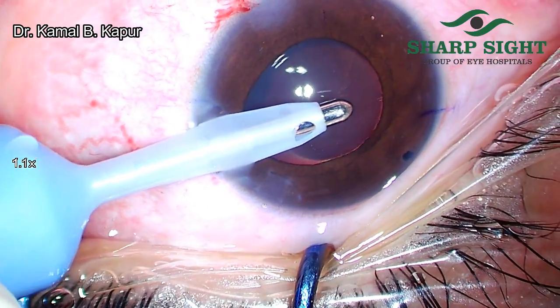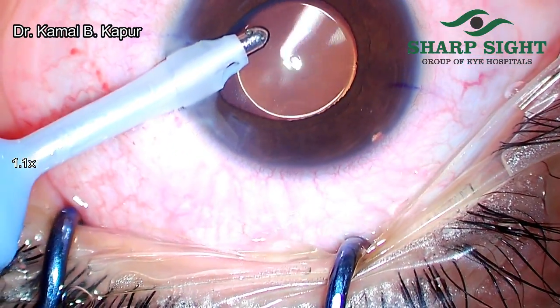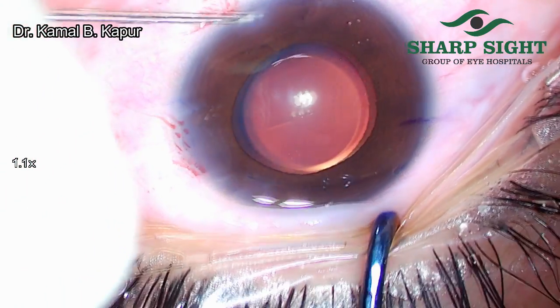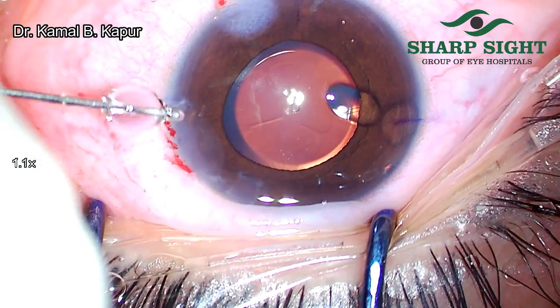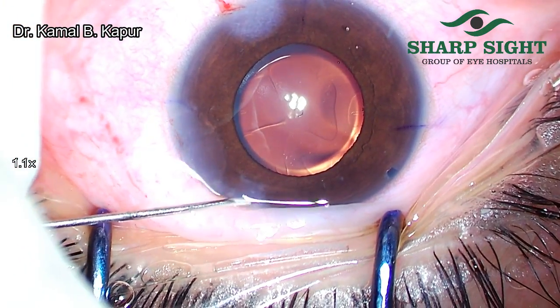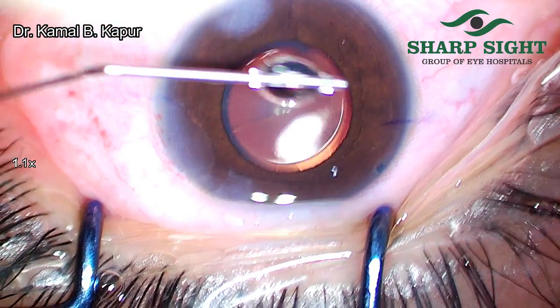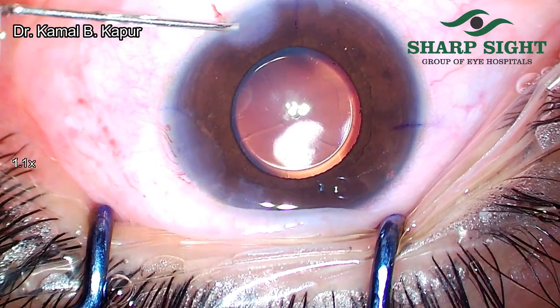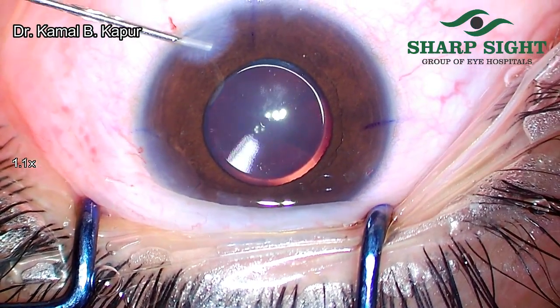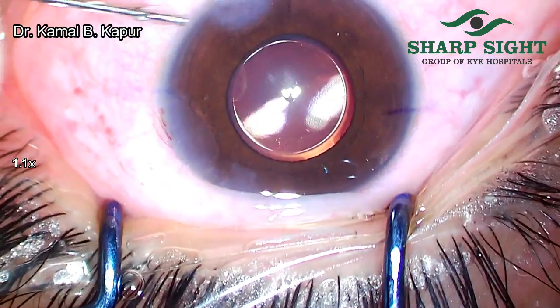What I have noticed is that it works excellently once you place your aspiration port 90 degrees perpendicular to the central hole of the ICL, making sure that your wound viscoelastic is addressed. This process has been fast-forwarded and edited, though I would recommend a very meticulous viscoelastic removal. Even though you can't remove 100% of the viscoelastic from behind the phakic lens, you should endeavor to remove the maximum amount.